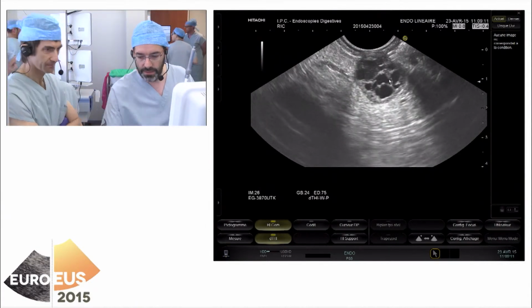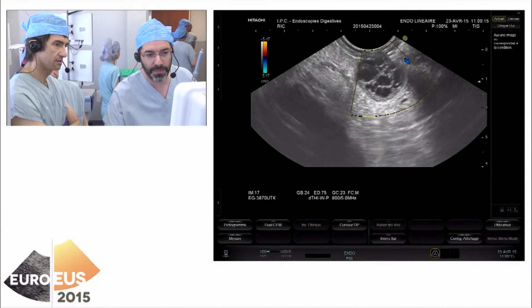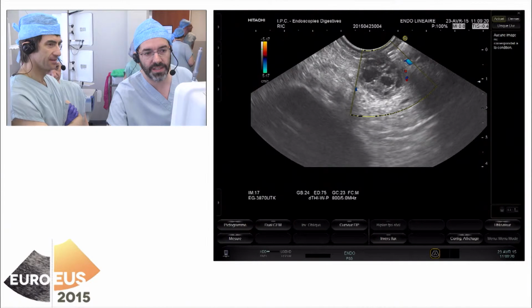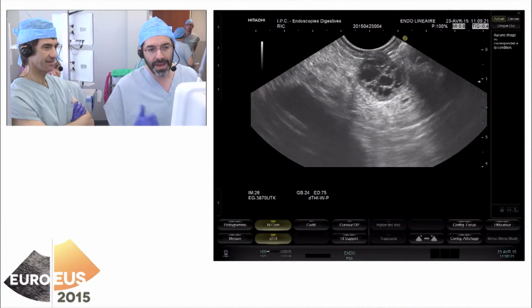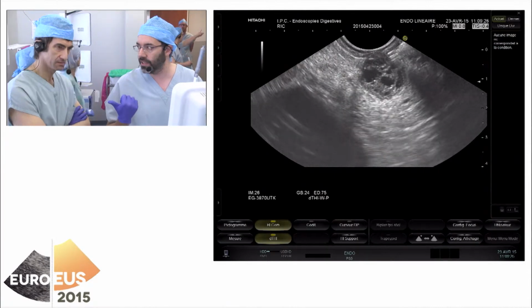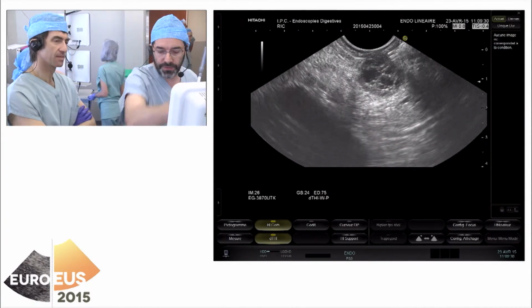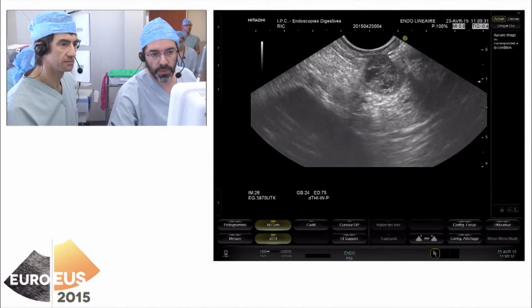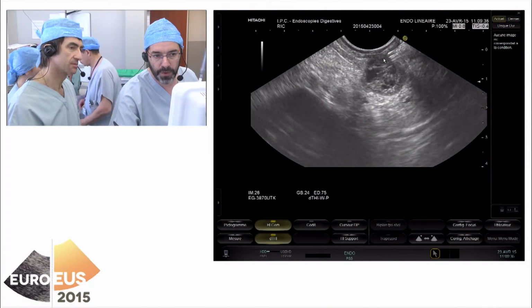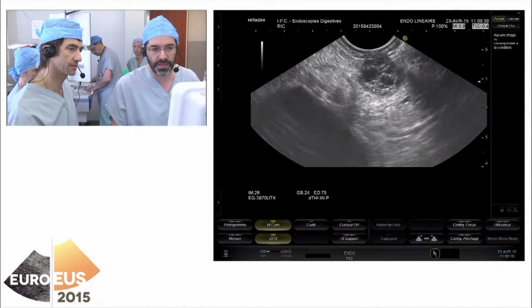Well, okay, so for the puncture, as a standard, and this is just the technique for any kind of puncture, we first check for vessels, and we see clearly this is going to be quite safe. And we've discussed, probably in this case, the best thing also for a cytological needle from the beginning is that we can sample from the first part of the wall, and we can take the needle to this area, so we can really sample the complete area, and this is one of the things of using a cytological needle.